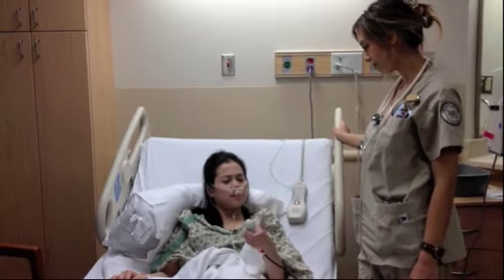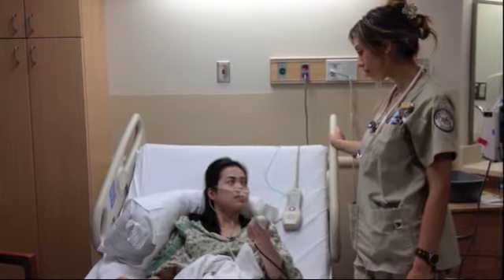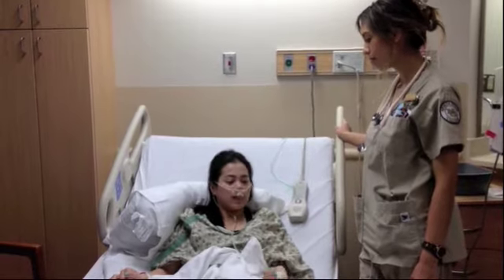I keep pressing this button over and over again, but I don't think it's giving me any pain medications. I'm still in pain. I'm very upset. I don't understand why I'm still in pain when I have this.